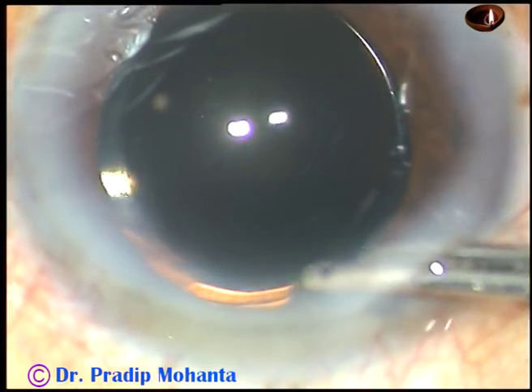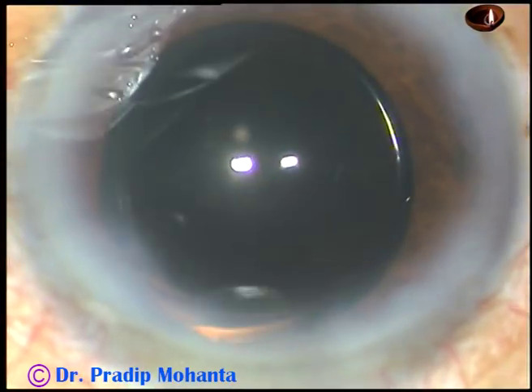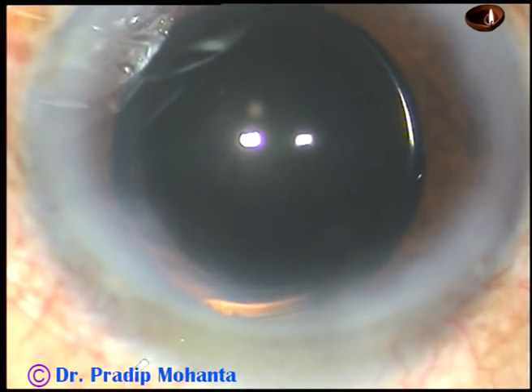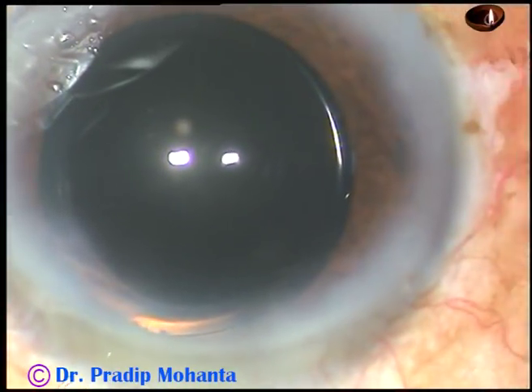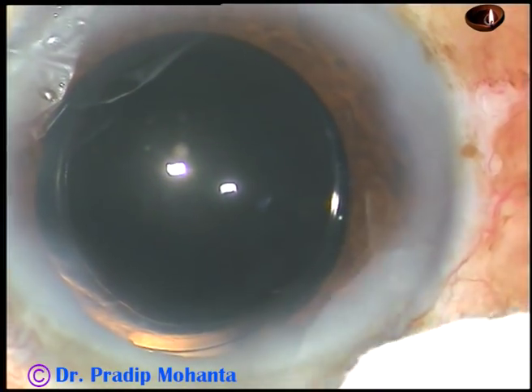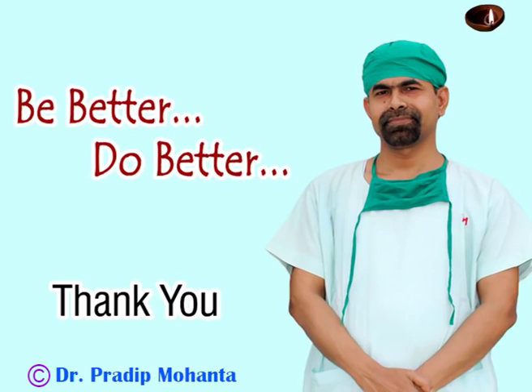And that's it. The anterior chamber is formed nicely. Then check the integrity of all the wounds — there should not be any leakage from any site. Use a cotton-tipped applicator to check the integrity of the wounds. Thank you very much for watching. Hope this video will help you in learning the stop and chop technique of phacoemulsification. Be better and do better.